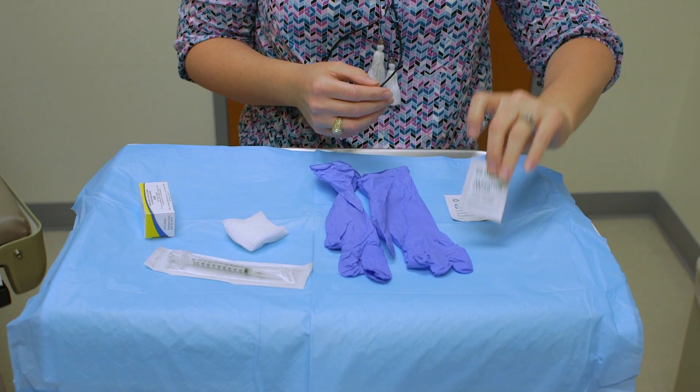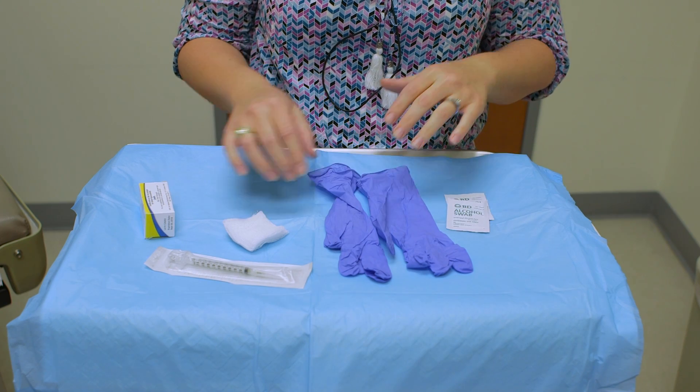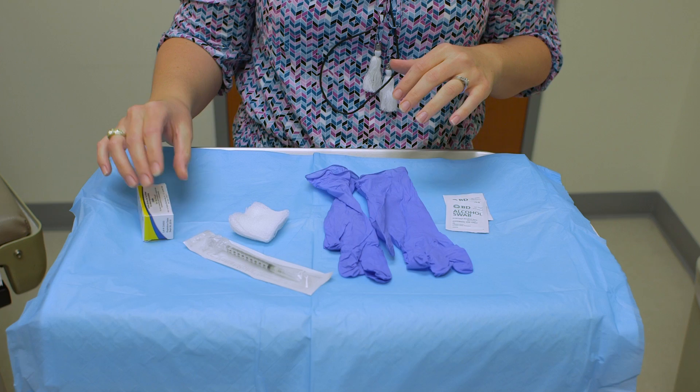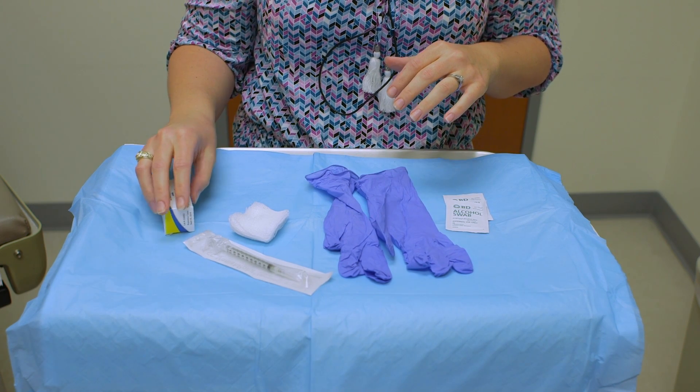Today we're going to be learning how to place a PPD test. These are the items that you're going to need: an alcohol swab, gloves, gauze, a 1cc syringe, and your tuberculin.